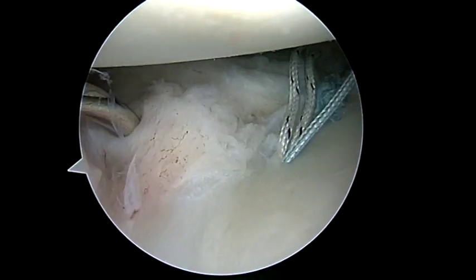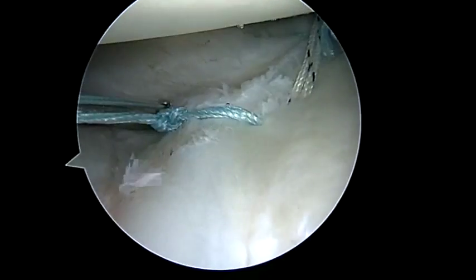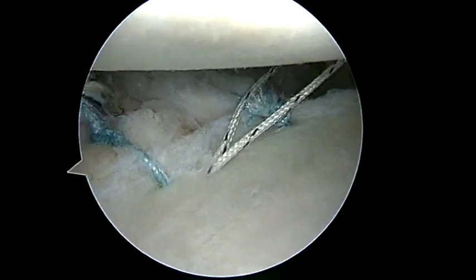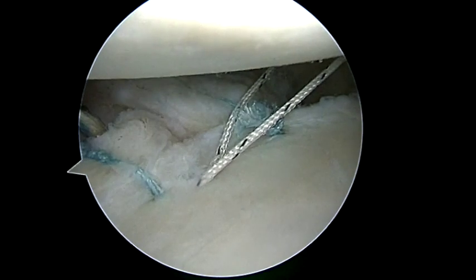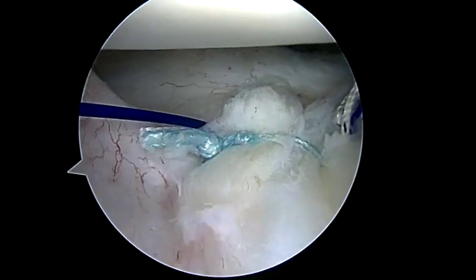The Spectrum device is then placed through the 7 o'clock portal and a simple stitch is placed through the IGHL and intact labrum. The capsular tissue should be shifted in an anterior and superior direction. This is achieved by piercing tissue more posterior than the location of the anchor and is the primary advantage of using a 7 o'clock portal.